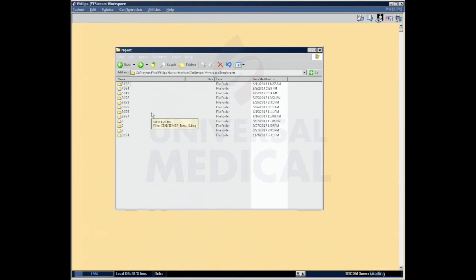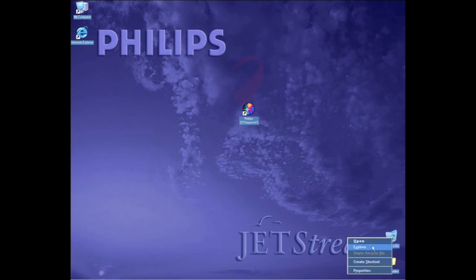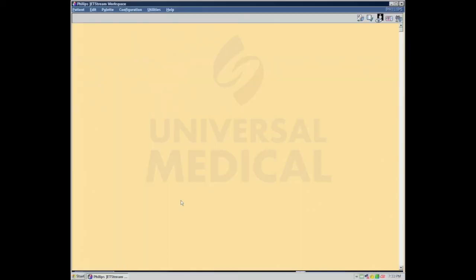And so if you say, well, I really want to save those reports from a year, I want to save reports that are done within the last year, you just choose the date prior to that, sort by date, choose the date of the start of where you want to start deleting, go to the end, say delete. Always remember though, empty your trash bin. If you do not empty your trash bin, you have not truly removed everything. I hope this makes sense, and I hope it helps you to clear up your database issues and understand where some of the locations are that you can have problems.